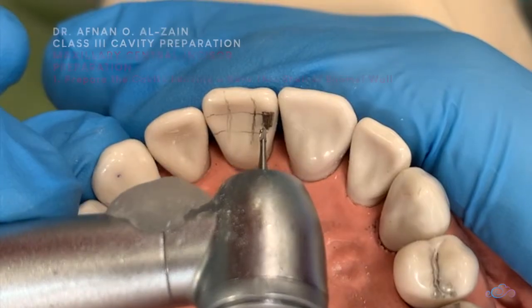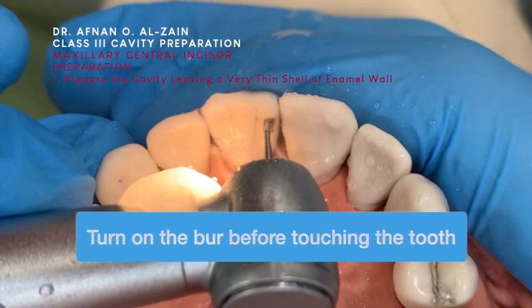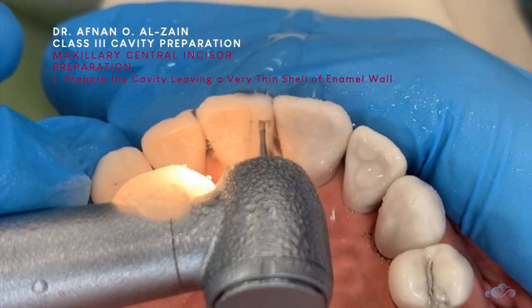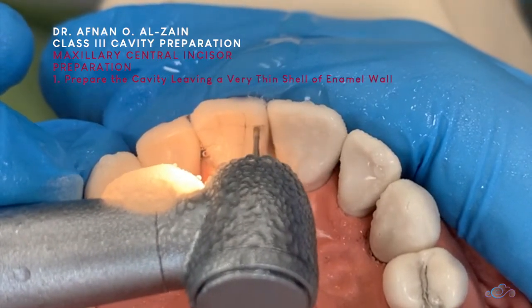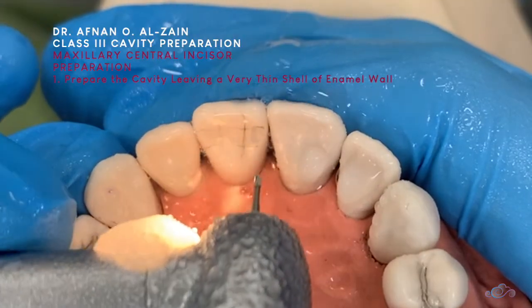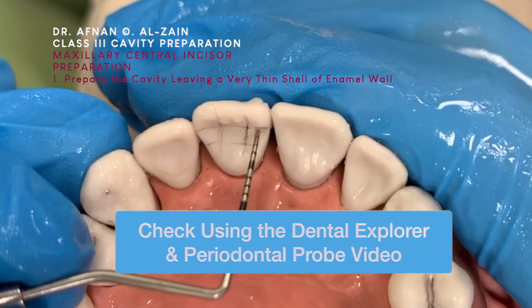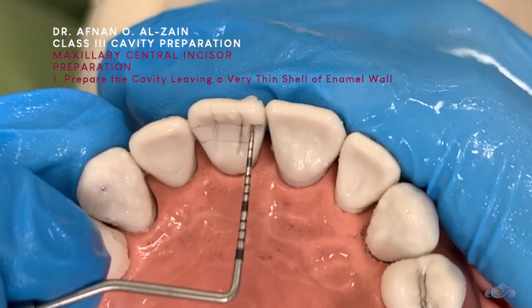We will be in this way. For now, we are going to start. We will be in the middle third. And they will be in the middle third. We will be getting the middle third round.